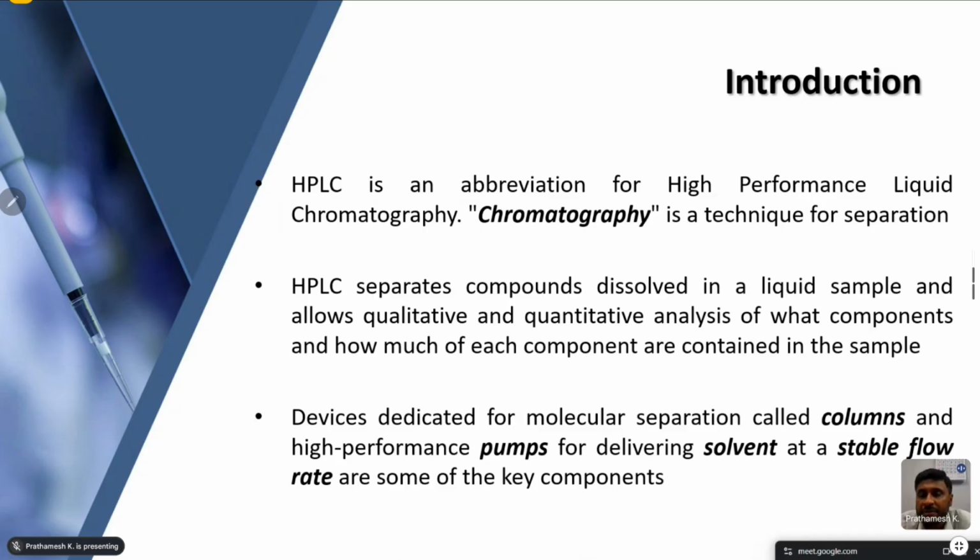Okay. So chromatography is nothing but a technique for separation. Whenever a question comes into your mind that I have a mixture which has n number of components in it and I want to separate out individual components, then the first answer which should come to your mind is chromatography.